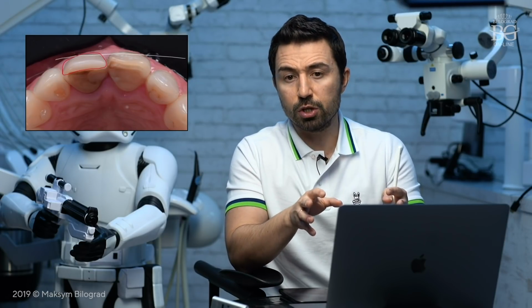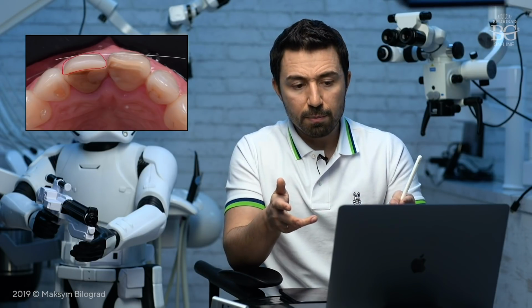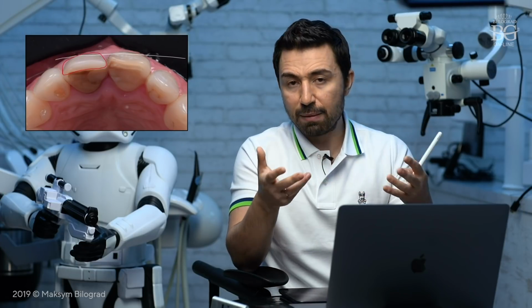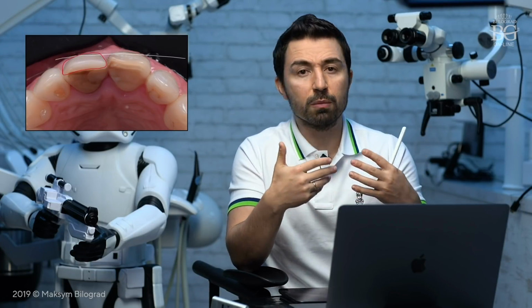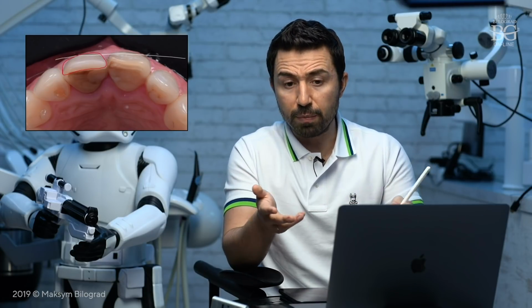Considering the fact that they are protrusive, in terms of restorative approach, we have to prep these teeth too much. If these teeth are vital, I would strongly suggest orthodontic treatment, because orthodontic treatment in this case was offered as an option and the patient refused. But since they are non-vital, we were okay. But imagine that these teeth are vital, and they are super protrusive with that type of caries defects. Maybe you will compromise vitality by the tooth preparation, which is not good from a biological perspective.